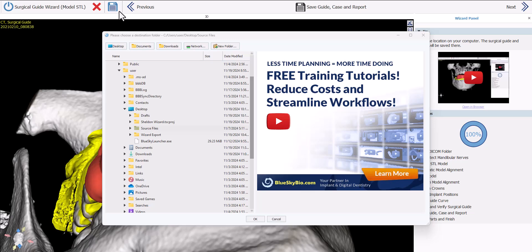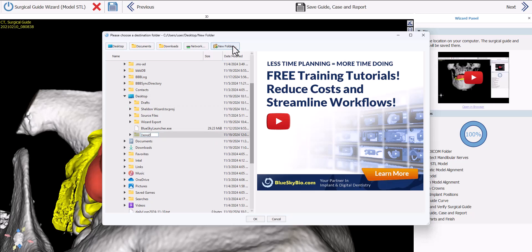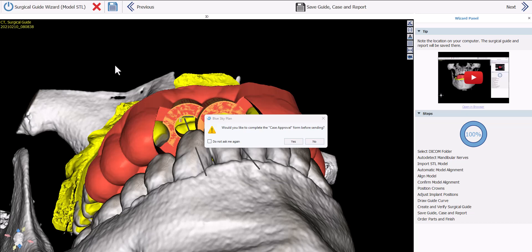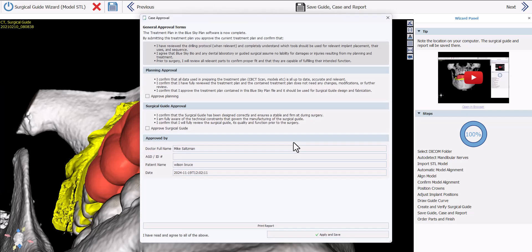Define the location where the project file and STL surgical guide should be saved — navigate to your desktop, click New Folder, name it, and click OK. The software asks if you want to complete the case approval form before sending. If you're sending the case to a lab, you can click Yes to approve the plan and surgical guide. This is optional. You have the option of printing and saving it.